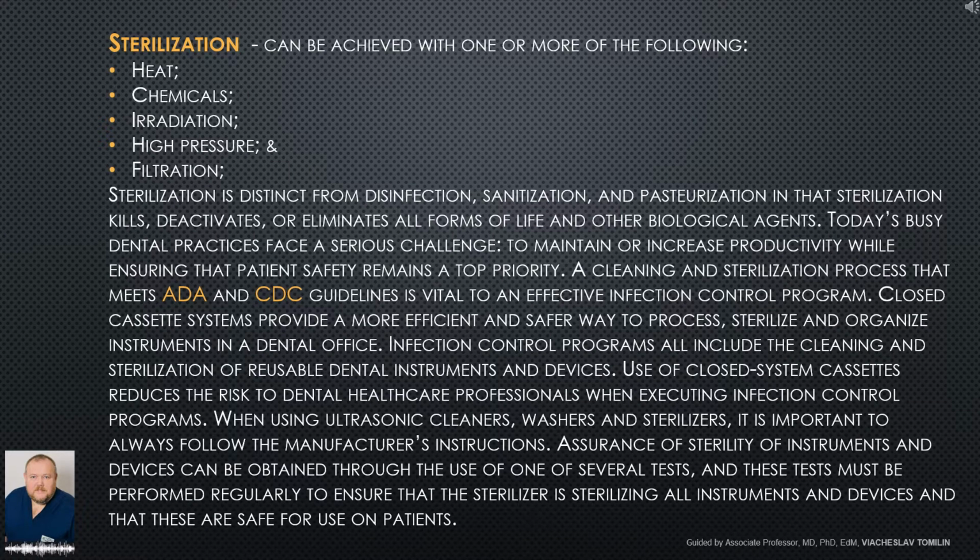Sterilization can be achieved with one or more of the following: heat, chemicals, irradiation, high pressure, and filtration. Sterilization is distinct from disinfection, sanitization, and pasteurization in that sterilization kills, deactivates, or eliminates all forms of life and other biological agents. Today's busy dental practices face a serious challenge: to maintain or increase productivity while ensuring that patient safety remains a top priority. At times, these may seem like incompatible goals. Advances in dental processing equipment, however, have empowered practices to develop safer processes while realizing efficiencies and ultimately, saving money.